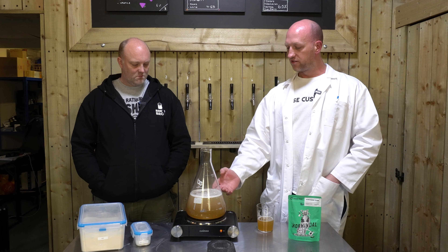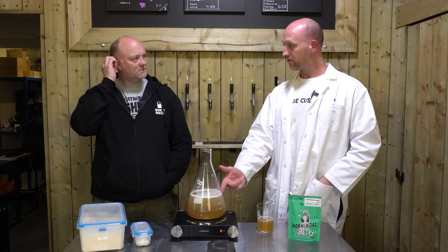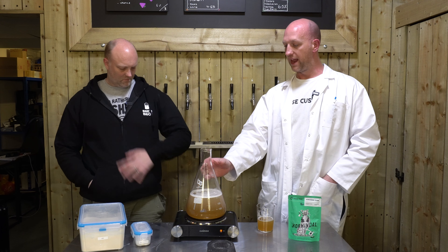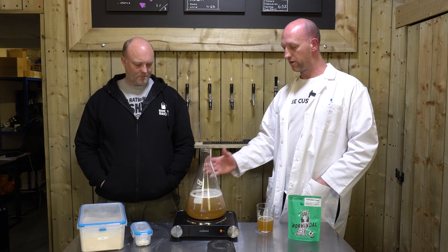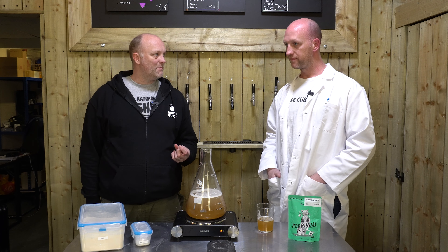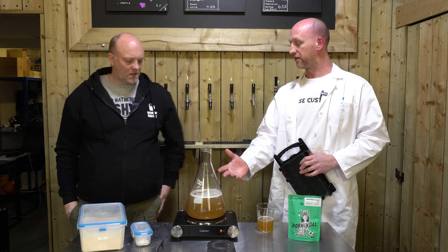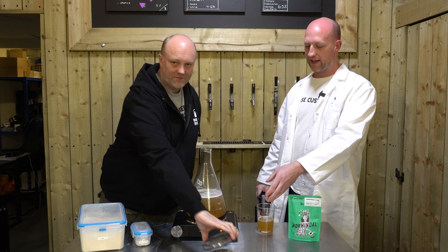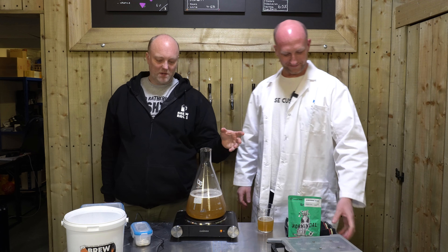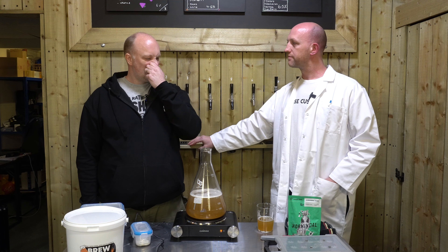Now we can just get this party started — crank it right up. You can tell when it's getting close to boiling because you start to see a few little bubbles appearing. When you're doing it at home on the hob, you don't want to let this boil over, because you've seen how sticky it is — it'll go everywhere. Once it starts going it'll properly go and quite often boils over. Once it's had the initial boil-over it'll then simmer a lot better. We've also got our magnetic stirrer. As soon as it gets close to boiling we want to turn the heat right down.